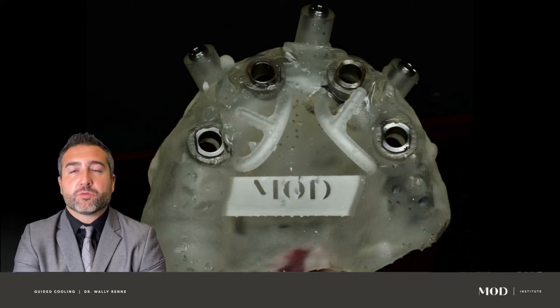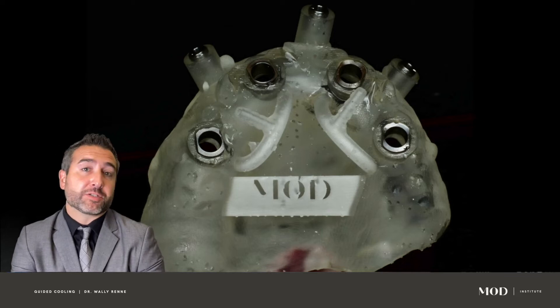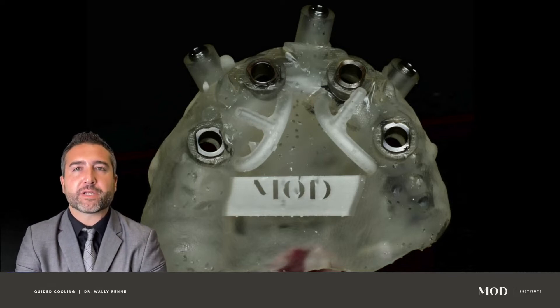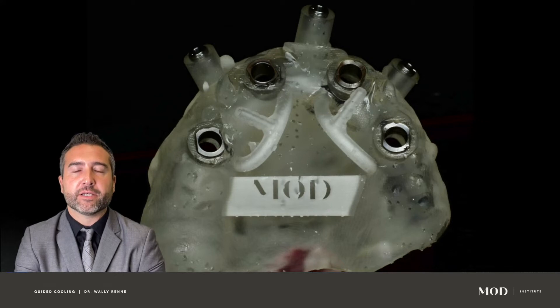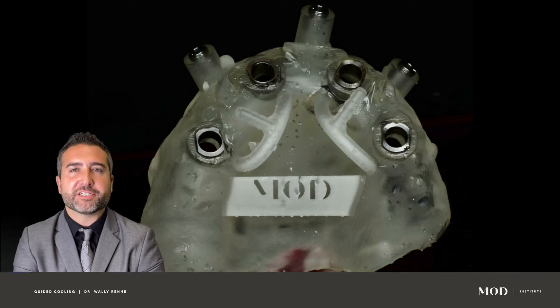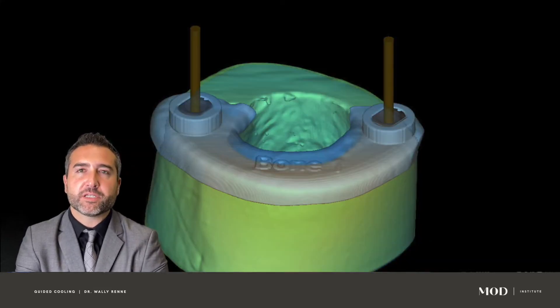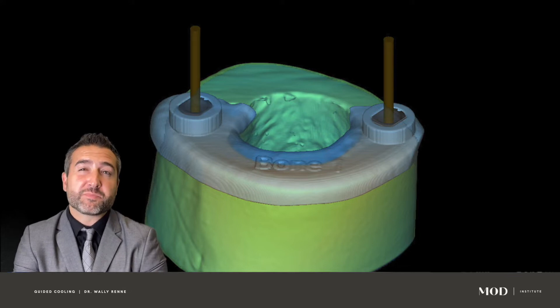When we use traditional drills that don't have internal irrigation and we're using a standard hookup to the handpiece, a lot of the irrigant is reflected off of the guide. Many people have created unique little holes so an assistant could inject irrigation through the guide, but this is the solution we've created at the Mod Institute — a unique evidence-based approach.